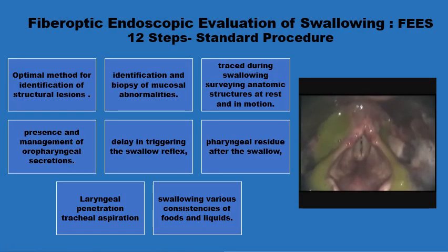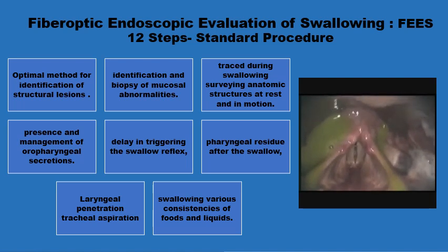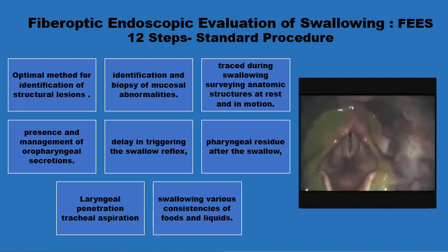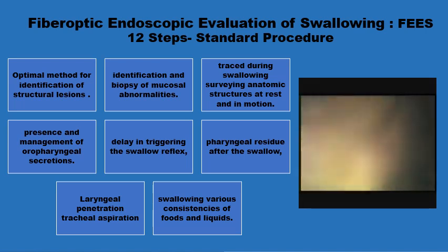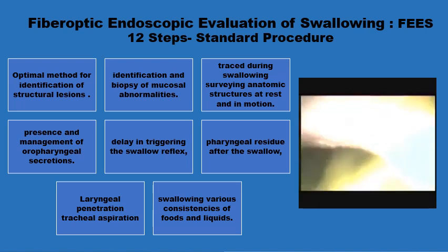The standard FEES procedure is a 12-step standard technique that can take anything between 20 and 40 minutes. By the end of the procedure, the observer should be in a position to identify the cause of the dysphagia, plan a management, and try to implement it.